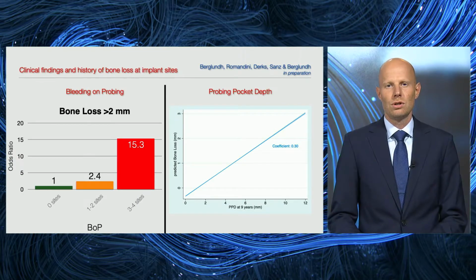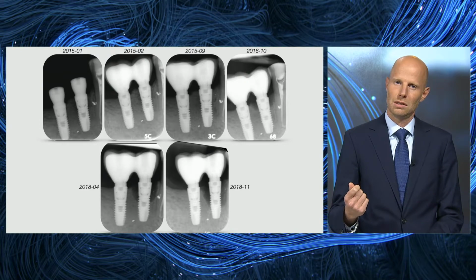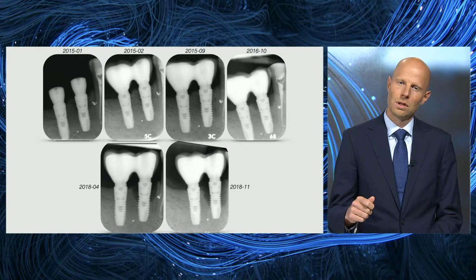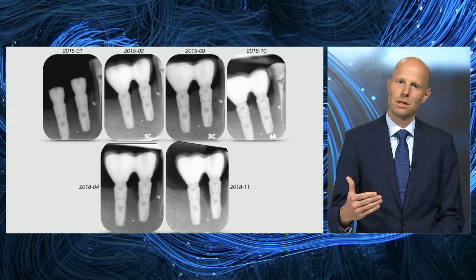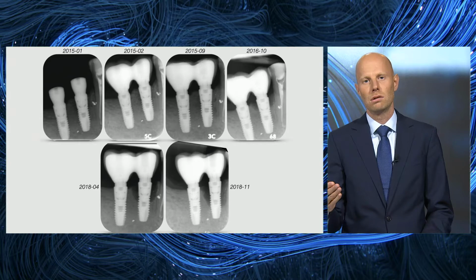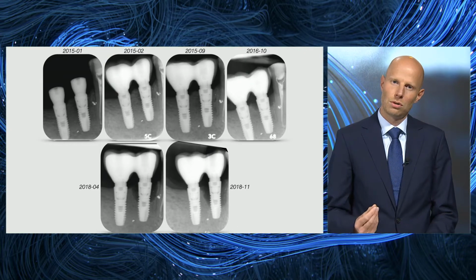We have to consider that peri-implantitis has its onset rather early in most cases, and as indicated in the two pictures at the bottom, it typically progresses rather fast. So a clinical tool that allows us to monitor implants easily over time is required. This cannot be the radiograph, because we can't take regular radiographs without a clinical indication. So this is very important in our concept, and that is the periodontal probe.